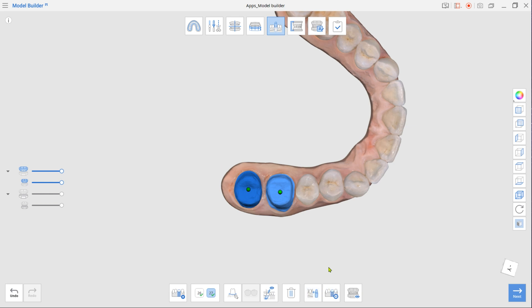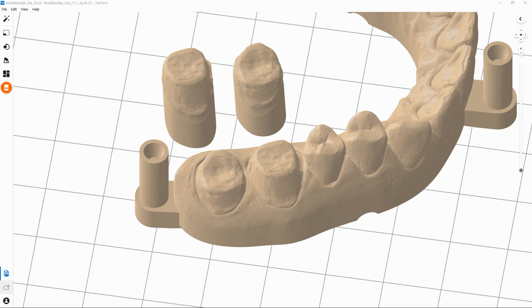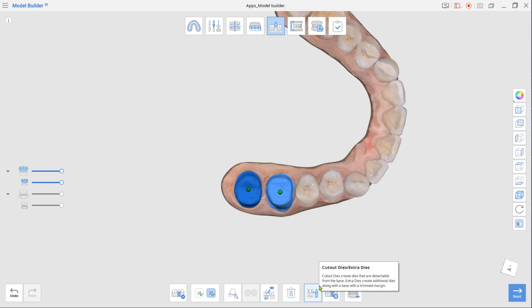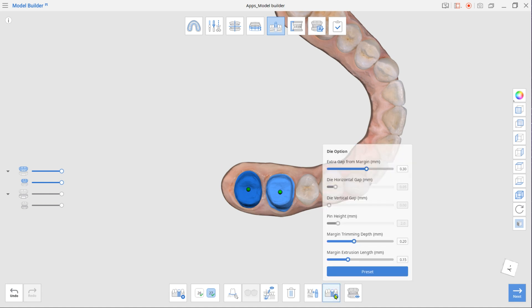In this case, the prepped teeth in the base will have trimmed margins. Finally, adjust parameters for the die fit using Die Option.